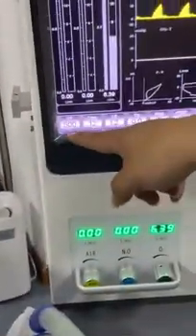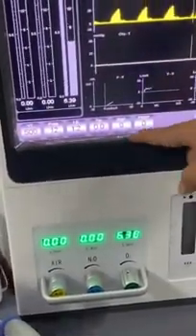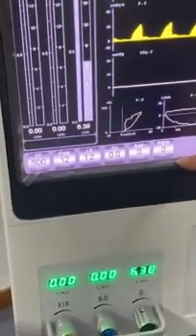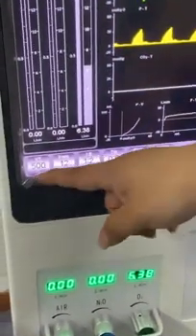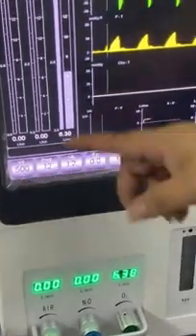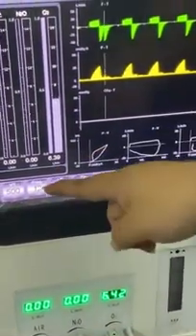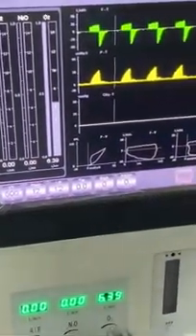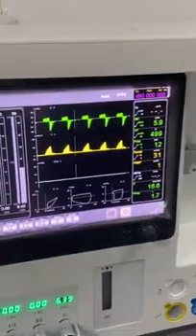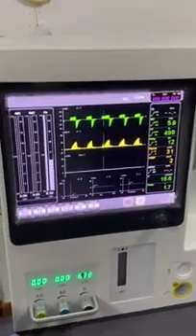And the last part is the below side. Here we can also see some parameters. These parameters are just what you have preset for the patient, so it's also for reminding the doctors to see if any settings are wrong. And the doctors can also check the adjusting parameters together with the monitoring parameters, so they will know if the patient is using the machine well or not.